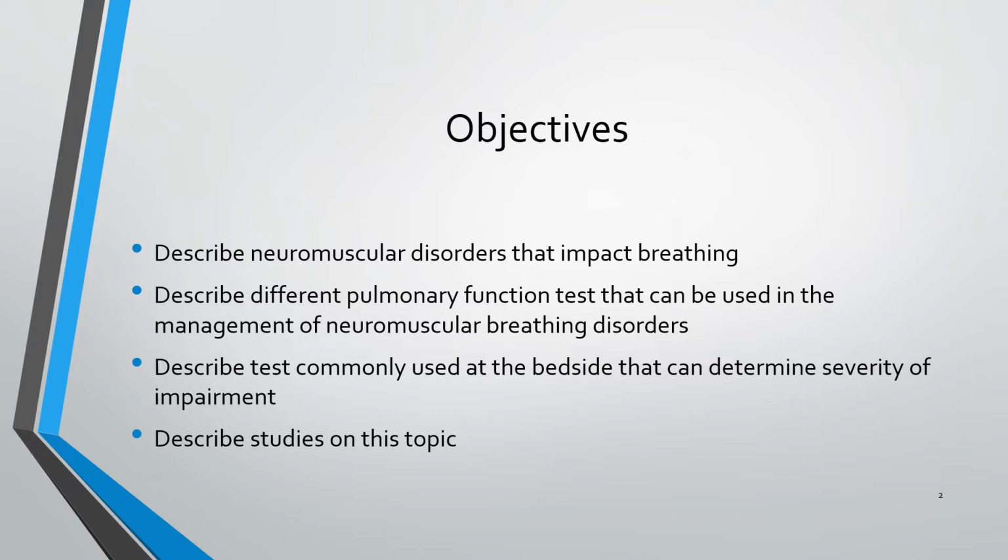We can do serial PFTs on them to see if their disorder is stagnant or if it's really progressing. I'm going to describe some tests commonly used at the bedside because not all pulmonary function testing is done in a lab. A lot of times with patients who are in bed, we do bedside spirometry on them, and we can do peak flows. We can do a whole host of things with them at the bedside.